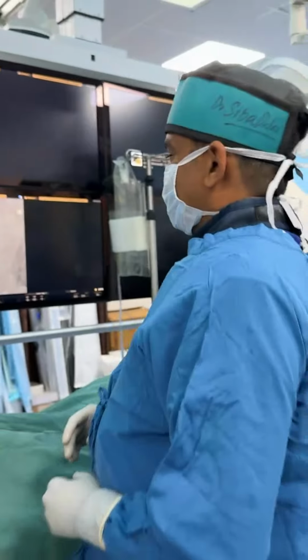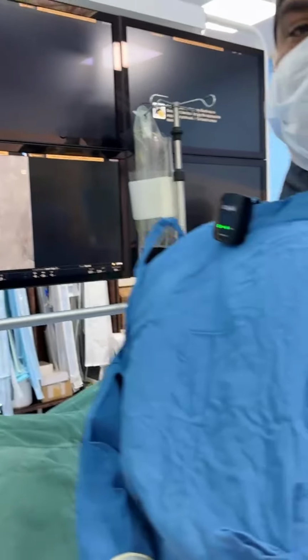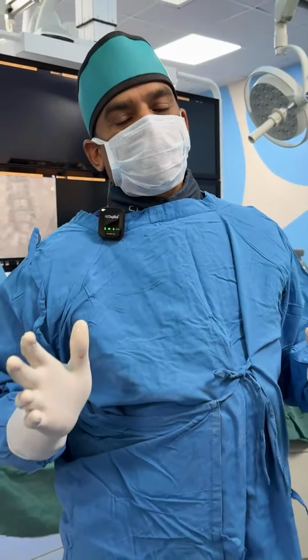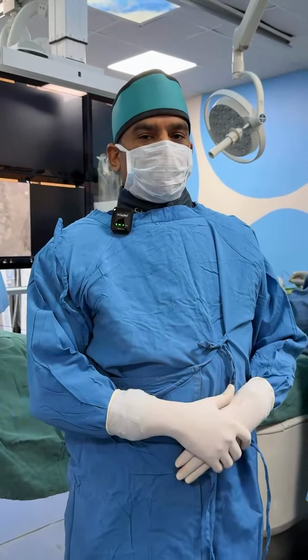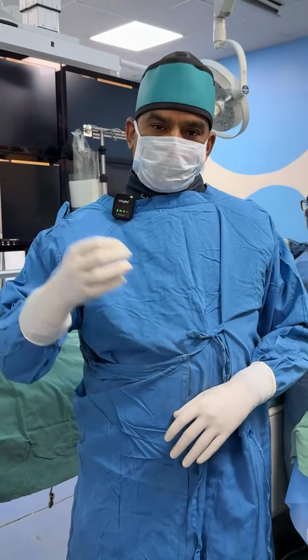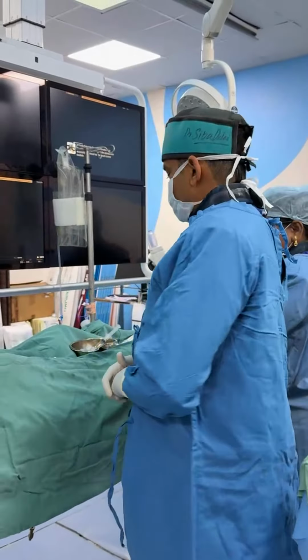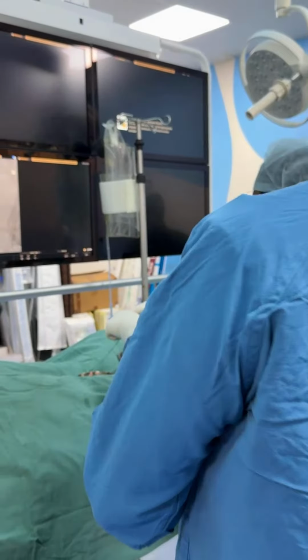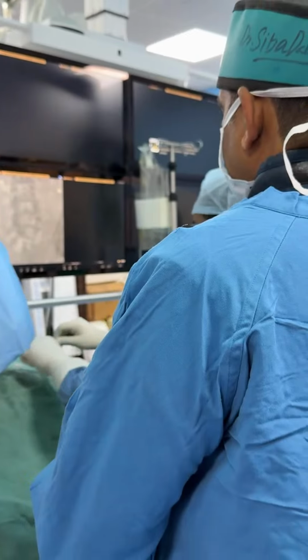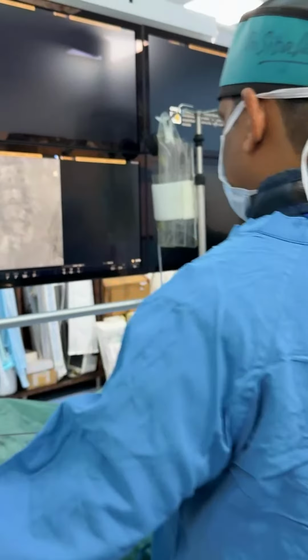So, we will take a RUC, the Robertson uterine catheter. Basically these uterine arteries will go inside the common iliac artery, from there the internal iliac artery, from there the anterior division into the uterine artery, and then we can occlude them by injecting polyvinyl alcohol particles.